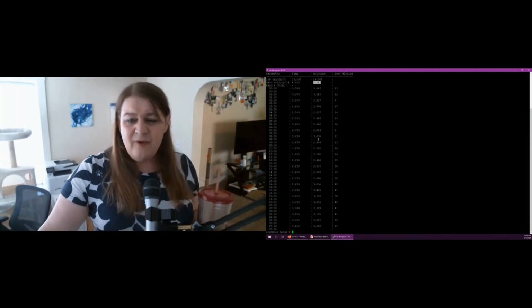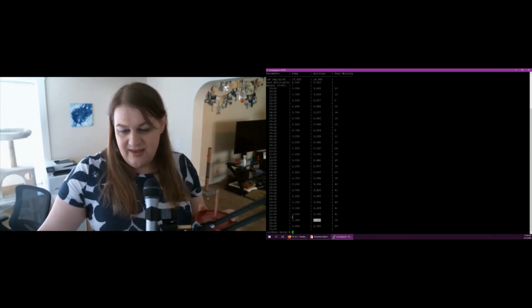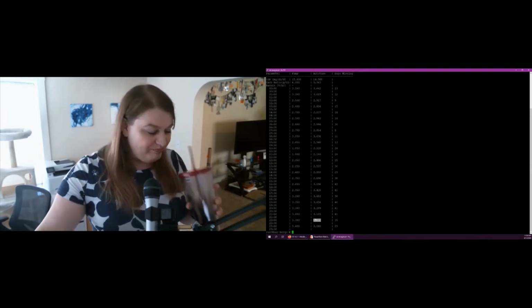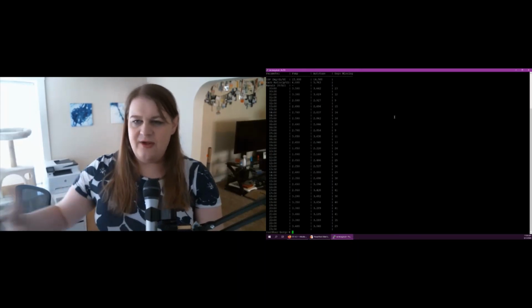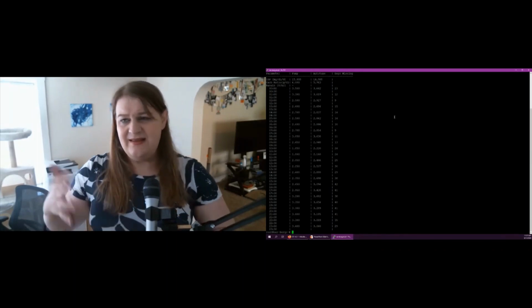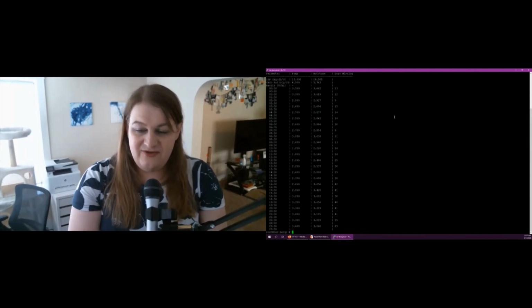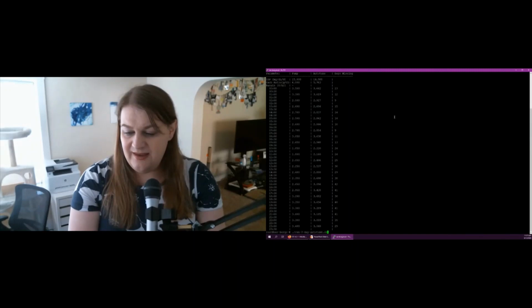And then every hour, like here, it thinks I should have a little more. Are there any less? Yeah, so like this one, about 10 p.m., it thinks I should have a little less than normal. So this is sometimes kind of handy to look at just to see how close am I on its expected basals and things like that. And it still auto calculates every 5 minutes. So this is sort of a once a day chart it produces. And I can always rerun some of this stuff.